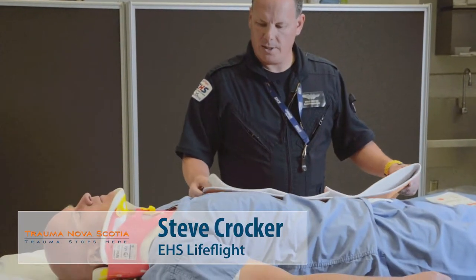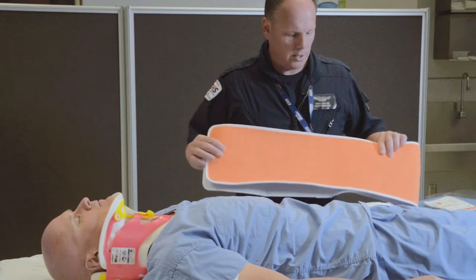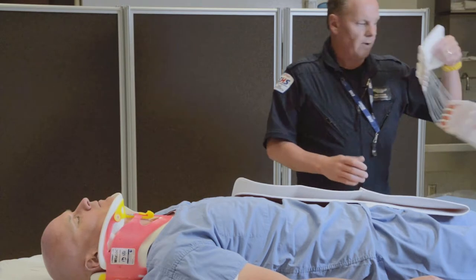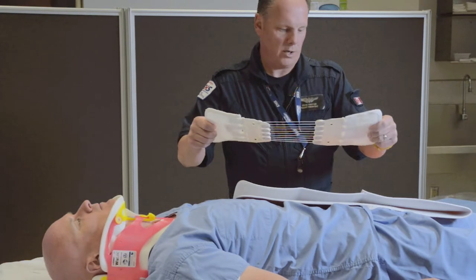We're going to introduce the application of a T-POD pelvic binder, which is used in unstable pelvic fractures in the trauma patient. This T-POD comes with a belt or binder along with a Velcroed stabilization device that's put on once the binder is in place.